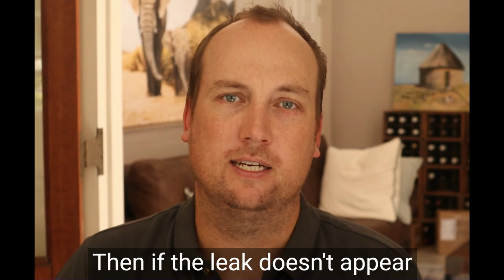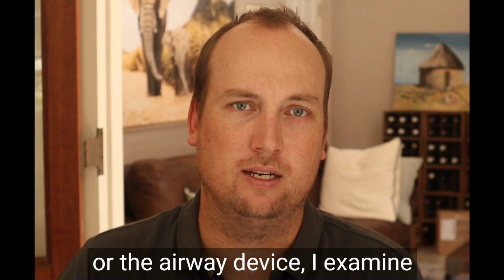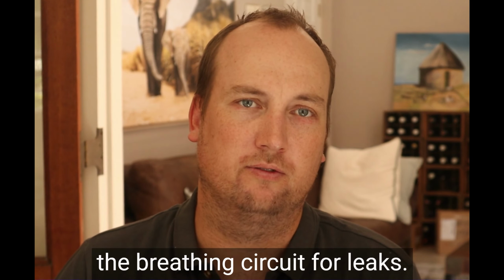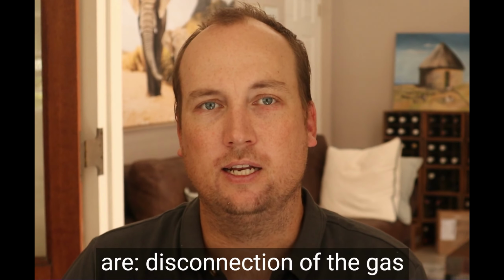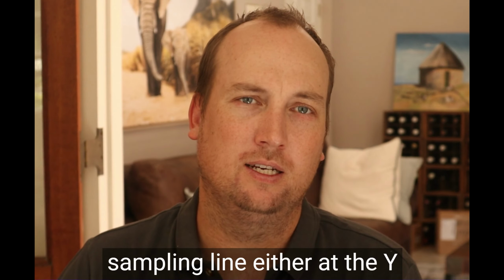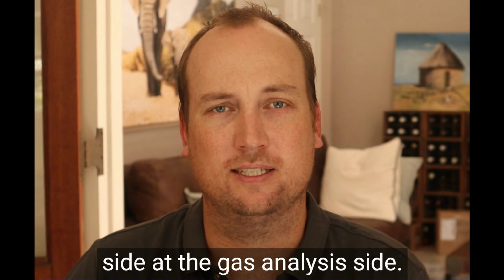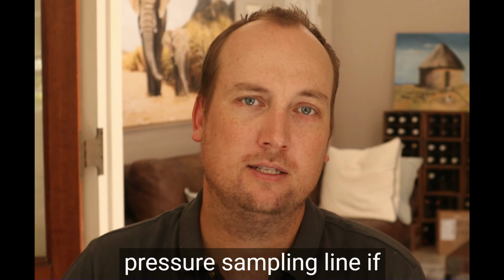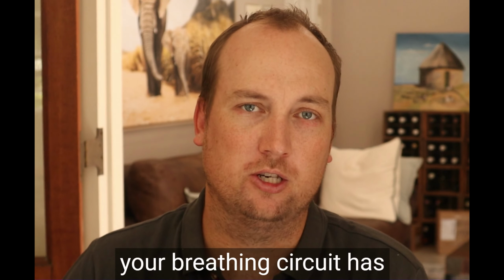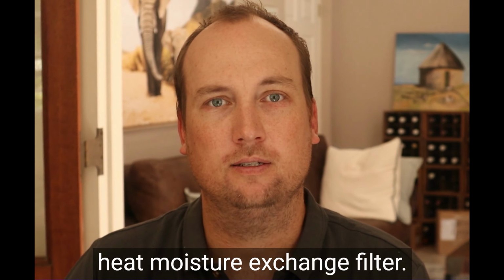Then, if the leak doesn't appear to be originating from the airway or the airway device, I examine the breathing circuit for leaks. Common causes of leaks are disconnection of the gas sampling line, either at the Y connector or at the machine side, at the gas analysis side. Disconnection of the pressure sampling lines, if your breathing circuit has pressure sampling lines. It could be an open port on the heat-moisture exchange filter.